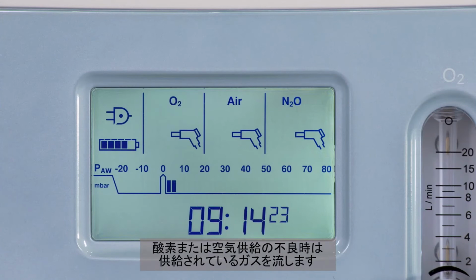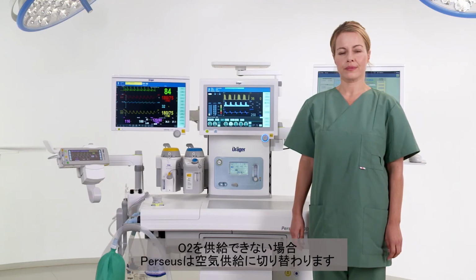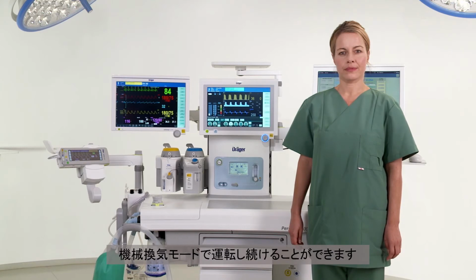Should the oxygen or air supply fail, the remaining gas will take over. In the case of O2 failure, the Perseus will switch to air supply. If the central gas supply fails to deliver oxygen and compressed air at the same time, you can continue operation in automatic ventilation modes.